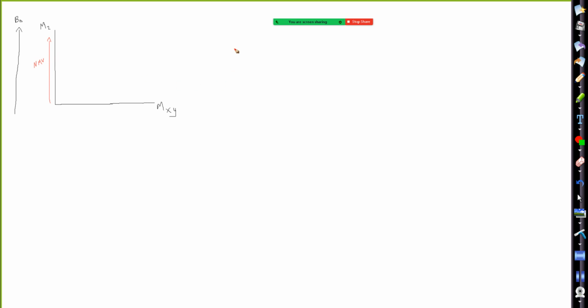And then when we applied an external radio frequency pulse, which was denoted with what? Not B0, but B sub 1. So this was our second magnetic field. And is this one moving or is it stationary? Oscillating. It's oscillating, so it's moving, right? And what frequency is it oscillating at? The same as the active nuclei. Same as the active nuclei. And at 1 Tesla, that was 42.57 megahertz. Okay? But it changes based on the static magnetic field. So that's where that Larmor equation comes into play.